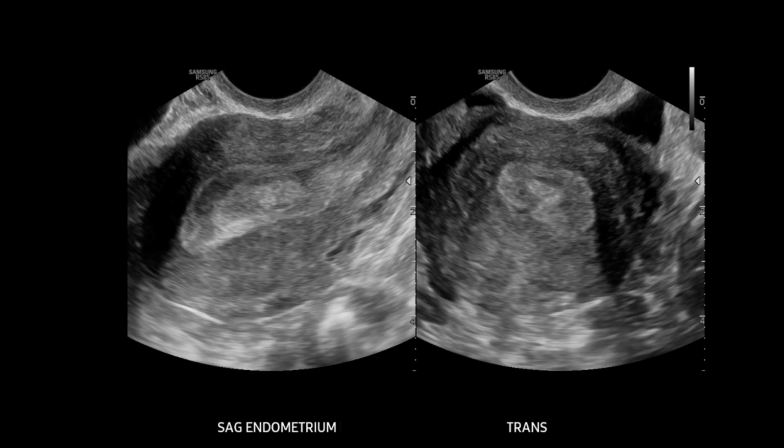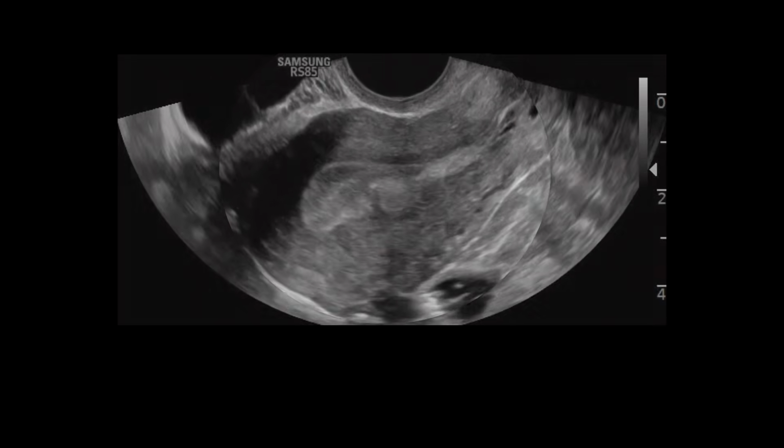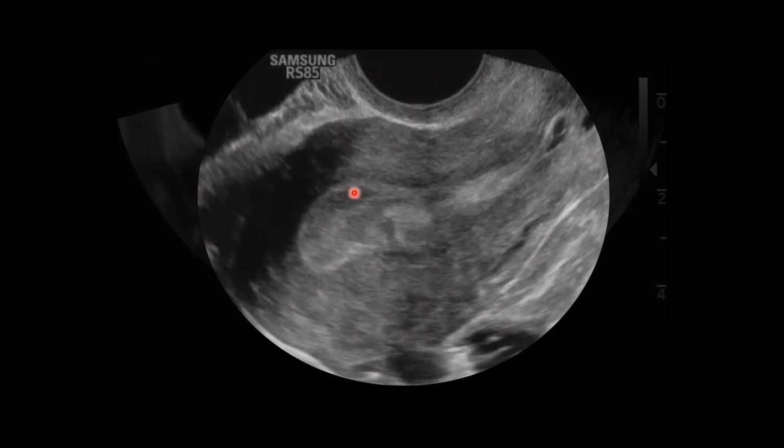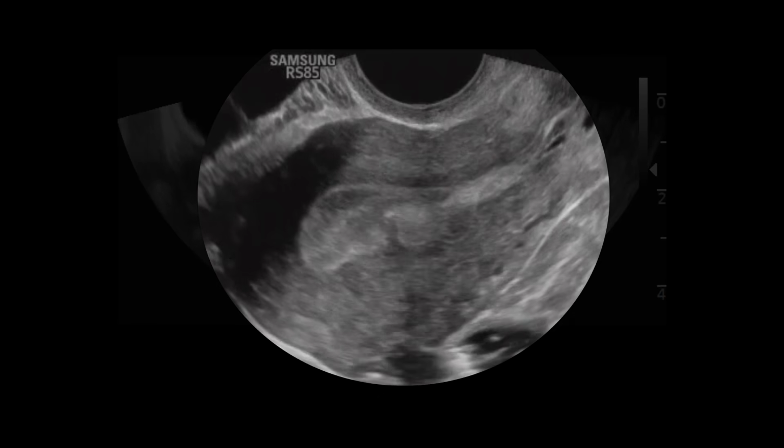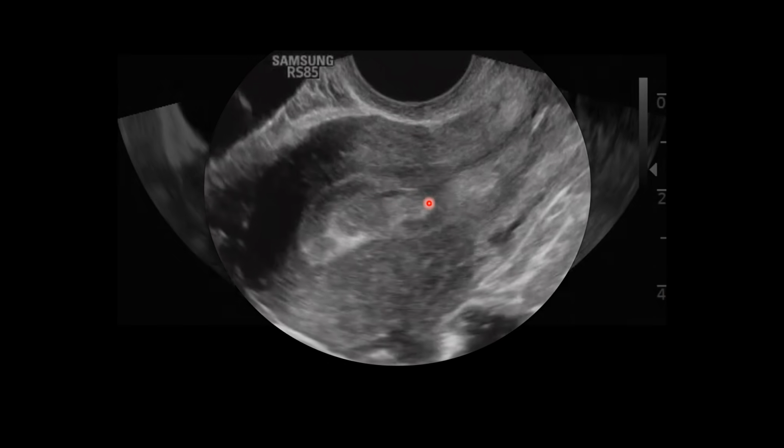If we look at that a bit more closely in sagittal and transverse, we can see that there's an echogenic ovoid focus measuring about 0.8 centimeters. There's a small hypoechoic halo at the anterior margin of this focus. Let's look at this on real-time imaging. Here on this long axis view, you can see the anterior margin of the endometrial stripe and the posterior margin. This thin echogenic line between them represents the two layers opposed against each other. And then within the posterior endometrial layer, that's where we see this ill-defined ovoid echogenic focus with this faint hypoechoic or dark halo at the anterior margin.